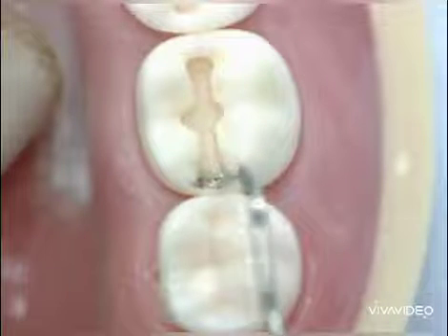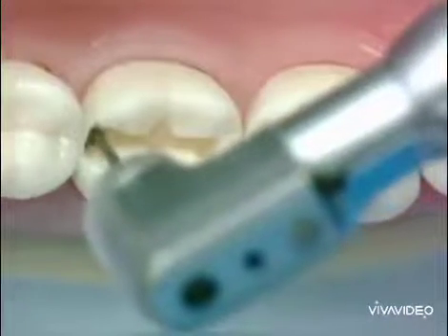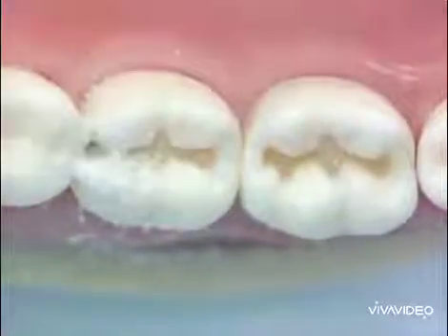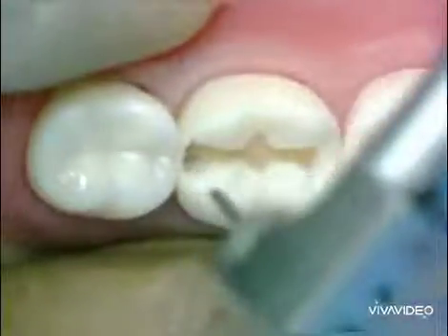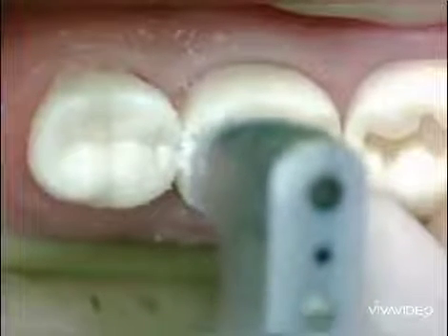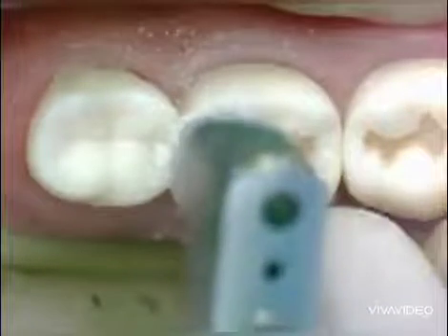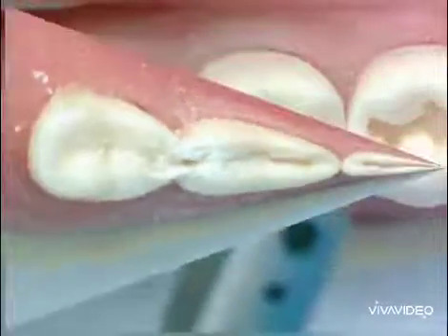Check with the probe for smoothness of the walls and the floor. Now, with a round bur, we do a 0.5 to 0.8 mm drop apically. Then switch to the fisher bur. Inside the hole, with the round bur, go buccally and lingually to create the axial wall and gingival seat, using a buccolingual wall movement with the fisher bur.